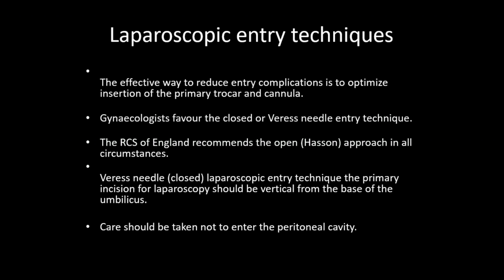The entry of any port should be at a right angle to the skin. So 90-degree insertion of the port, either primary or secondary, is the recommended angle of insertion. If you would like to insert a secondary port, it should be under vision.